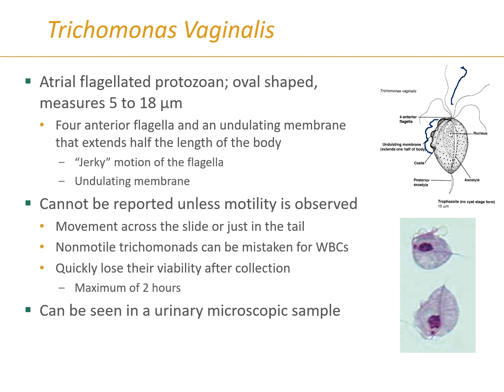So, and that's because if those things stop moving and you do not see movement, then you cannot report it. Even though you know it is trichomonas, you can't report it because it could be that the patient was previously treated and you just happen to get some dead cells in there. So that's why it's very important to make sure it gets sent to the lab promptly and tested promptly.